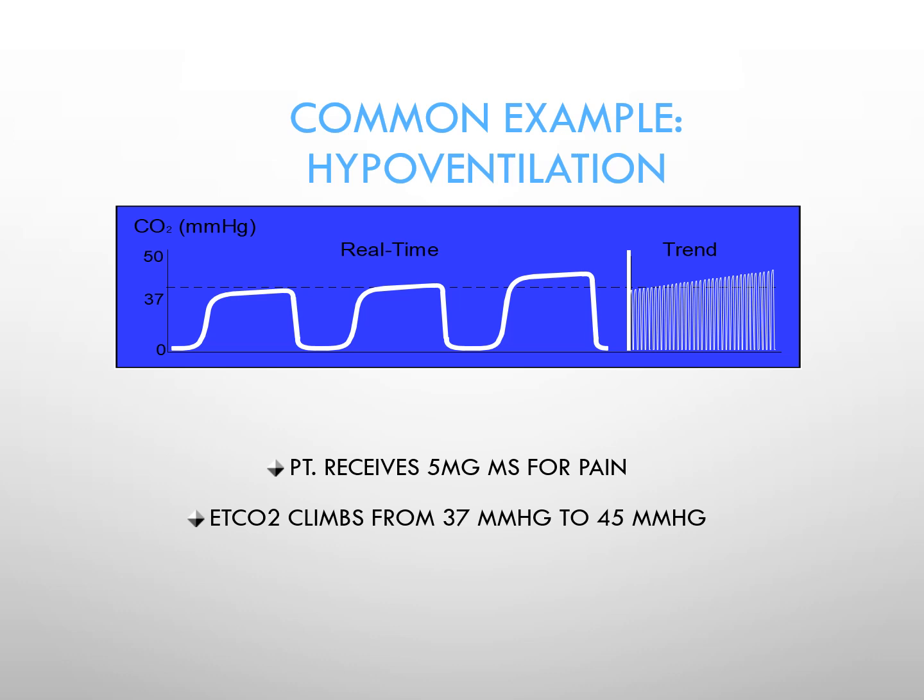Just to be clear on this, one of the main reasons, we talked about the indications for end-tidal capnography.